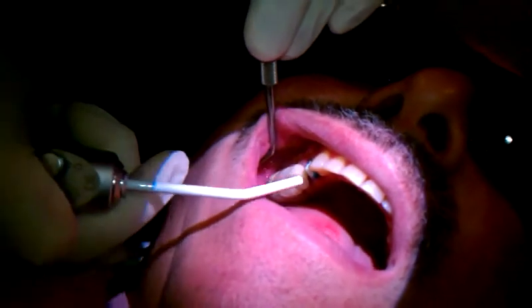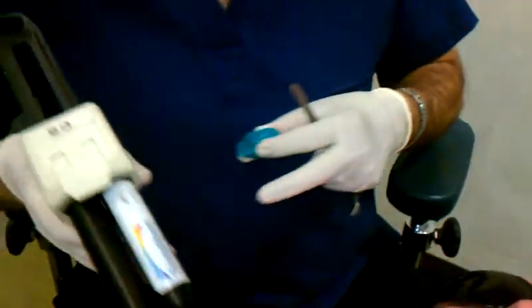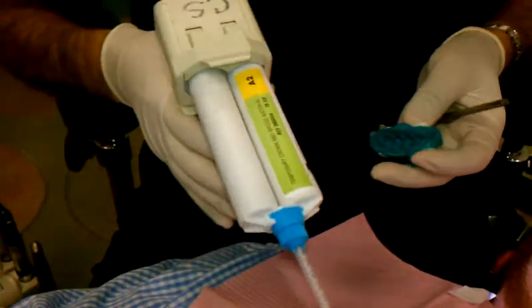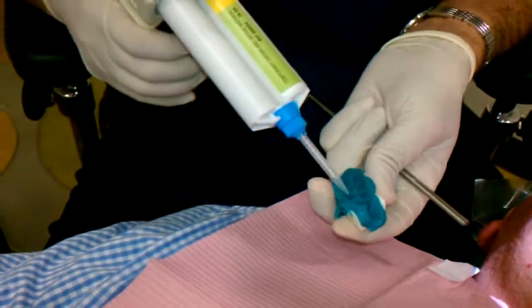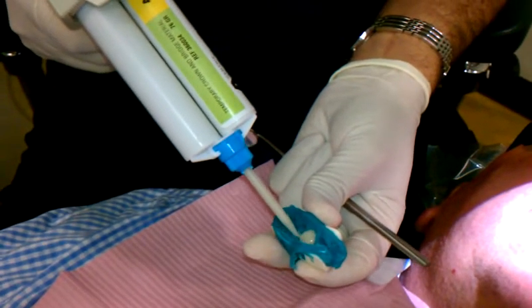And I made sure that the margins on the tooth are good. I take the impression that I've taken, and I'm going to put the acrylic material in there. We can use either — this is TempSpan from Pentron Clinical, and this is Centrix Access, which is also the same. I believe 3M also has it. Any one of these injectables, I'm going to go ahead and put the acrylic material into the impression material.